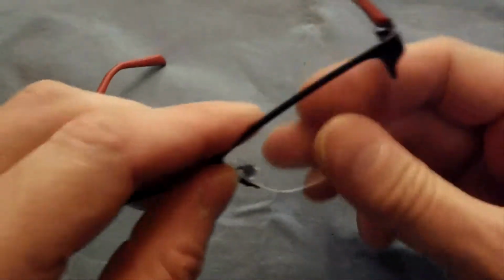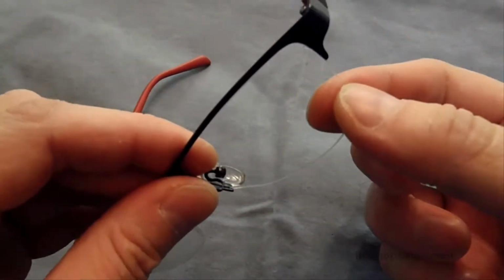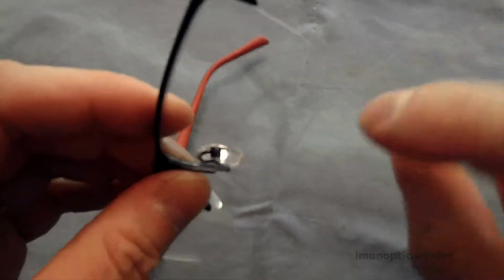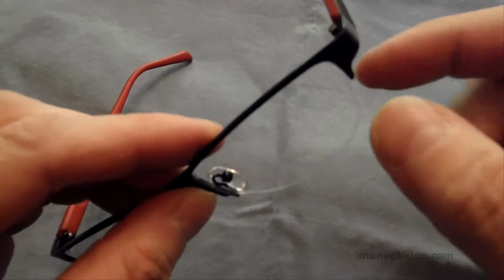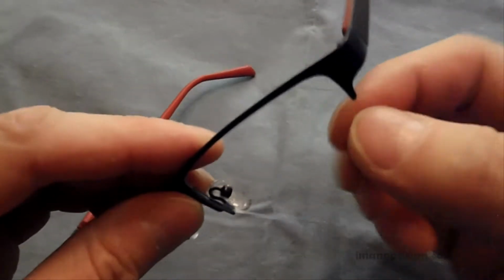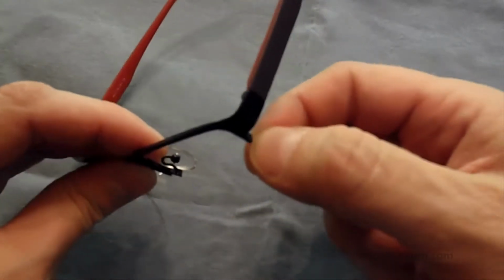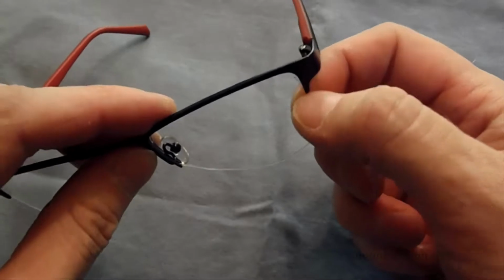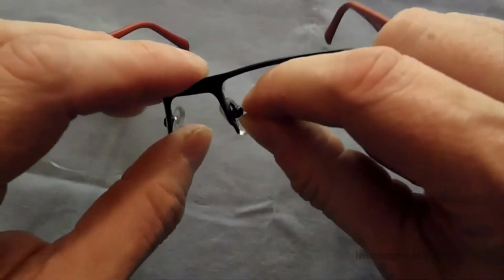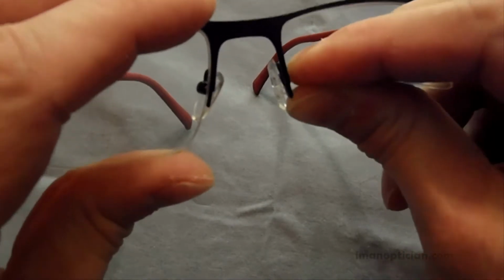Usually it takes me longer to get out the old eye wire than it does to get in the new eye wire. Now keep in mind, when you get these in, they're not going to be nice and new like this. They're probably going to be brittle, cut off. You'll probably find that it's cut off quite close here to the end, and you will find that it's hard to get out sometimes. Now when they're new, you can just pry this open and push that through.